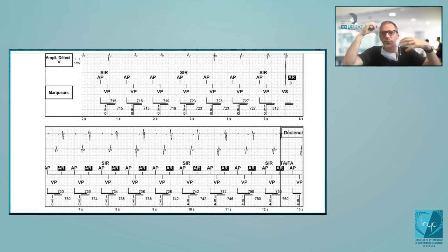So AP is very close to this one, maybe too close. So it's in the refractory period of the atrial myocardium. So you will not capture here. Since you're not capturing, you will deliver AP, VP, but you're not capturing. So there is quite a duration from this signal to this ventricular pacing. So there is a possibility of retrograde conduction. And it's going to be repetitive like that.